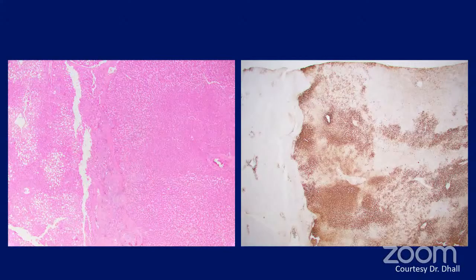This is an example of an inflammatory adenoma, and you can see that the background liver is steatotic, and then you have these very dystrophic arteries. This is the adenoma, with no good portal vein, and this is the glutamine synthetase. You can see that it has this patchy staining, especially on the periphery of the lesion, which, if you were on a needle core biopsy, can be mistaken for the map-like pattern of staining.